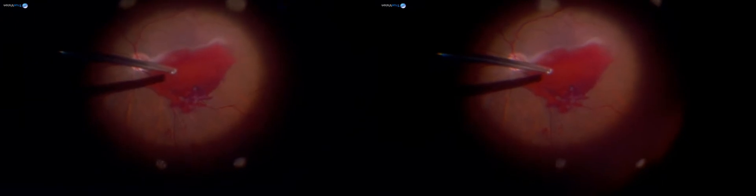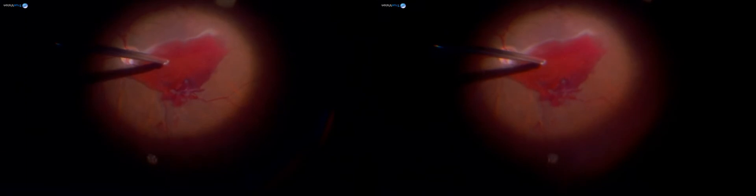Now I'm approaching the hemorrhage while I can see. I'm going gradually — this is a sub-hyaloid hemorrhage, typically a boat-shaped hemorrhage. If the patient were sitting up, you would see the boat shape much more clearly. It's lined by dehemoglobinized blood around the sides. I'll go into vacuum mode and start to see if the hyaloid is still attached here or not — and yes, the hyaloid is still attached, and that's holding the blood.